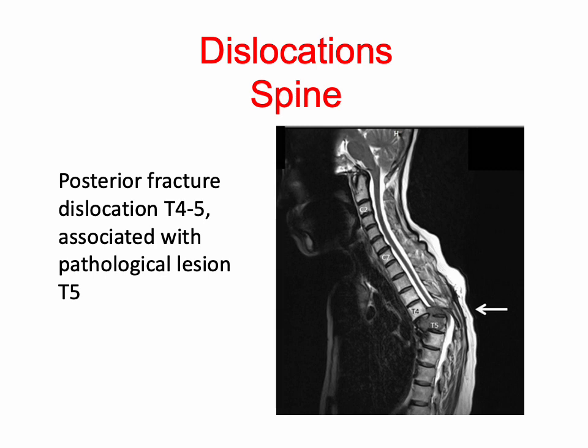And that's the end of our quick run through the basics of describing fractures. Like I said, we will get more into details of particular fracture types and fracture patterns in the relevant upper, lower, and spinal talks. But this was more meant as a guide to discuss how we talk about fractures and dislocations. And so when you're calling up orthopedics, or when you're on orthopedics and describing the fracture, you've got a framework about how to describe those.